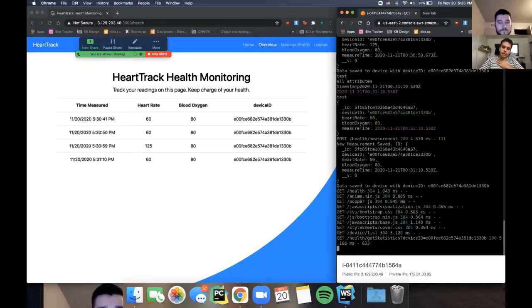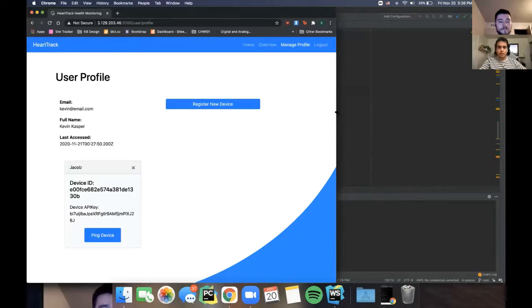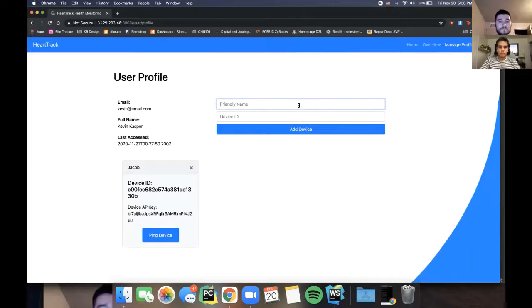Just checking back at the terminal again, we can see that we are retrieving the statistics through a GET request and passing along the device ID as the parameter. So we're going to log out here, and we'll log in. So we logged back in. You can see our device here. We still have our readings. And let's give it a friendly name.